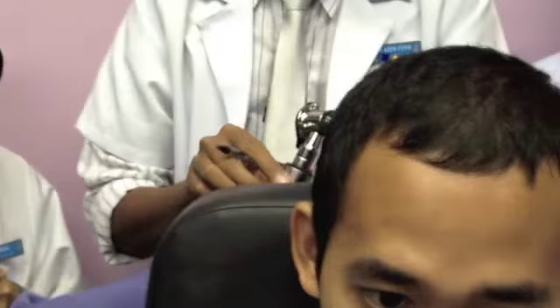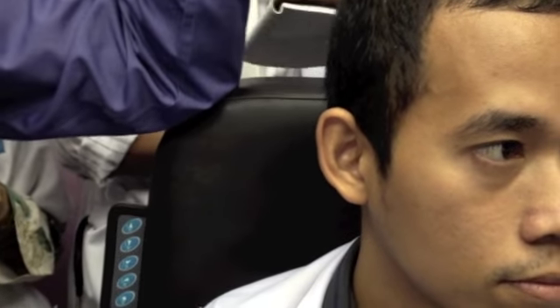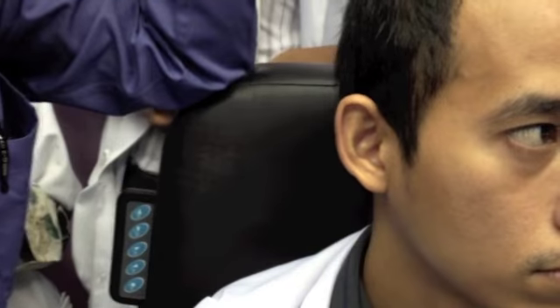Okay, now what are you supposed to see? Even while you are holding that, you have to. What are you supposed to see? You divide what? How do you want to go? Anterior. From external to internal. Good. External, from the skin on the wall to the inside. Good. Next, what do you want to see? Tympanic membrane. Oh, the external first. Find any deformity, any narrowing. Good. Patency of the canal. Good. Next. Any discharge. Good. Colour of discharge. Good. Next.